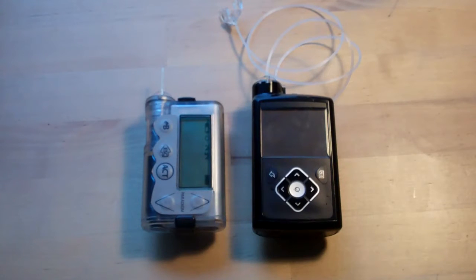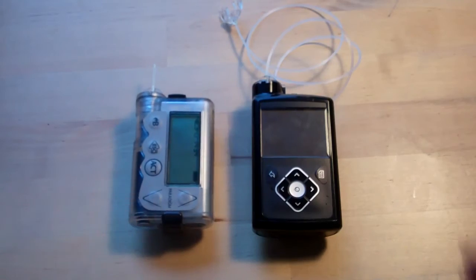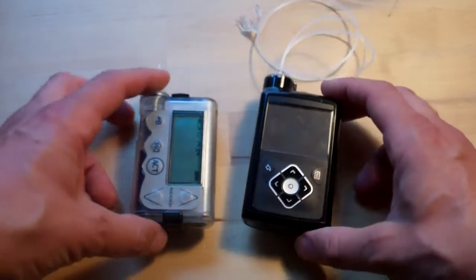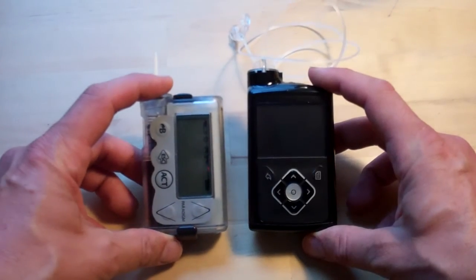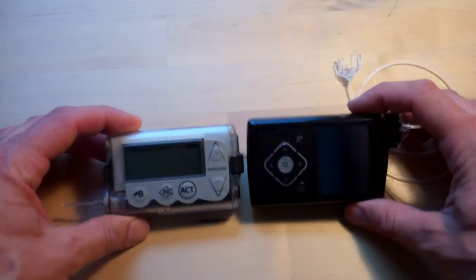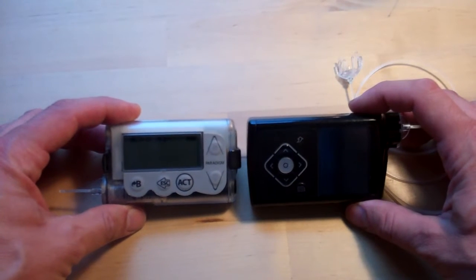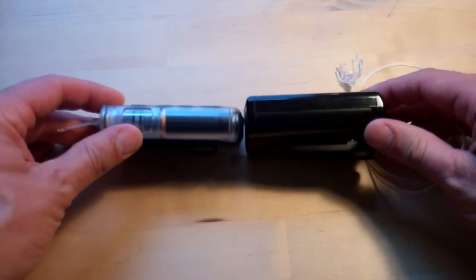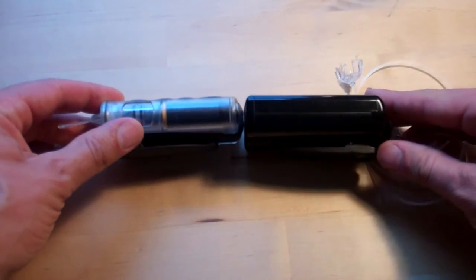Here's a side-by-side size comparison of my old Veo and the new 640G. You can see they're pretty similar — there's not a lot in it. The 640G is just a few millimetres wider, a few millimetres thicker, and a few millimetres longer.